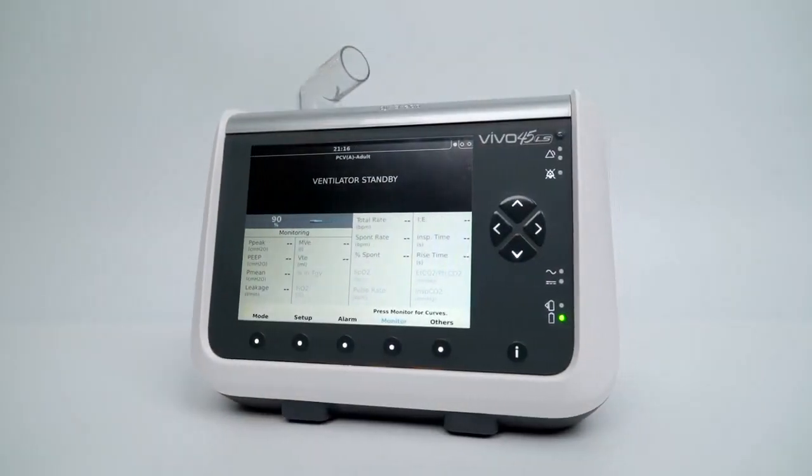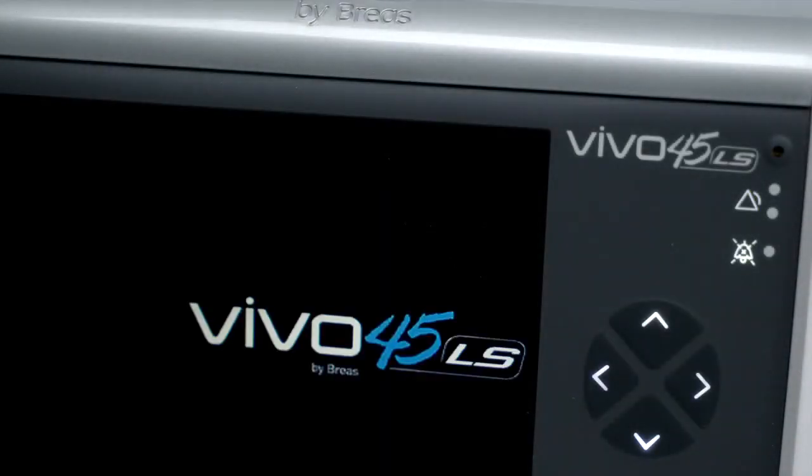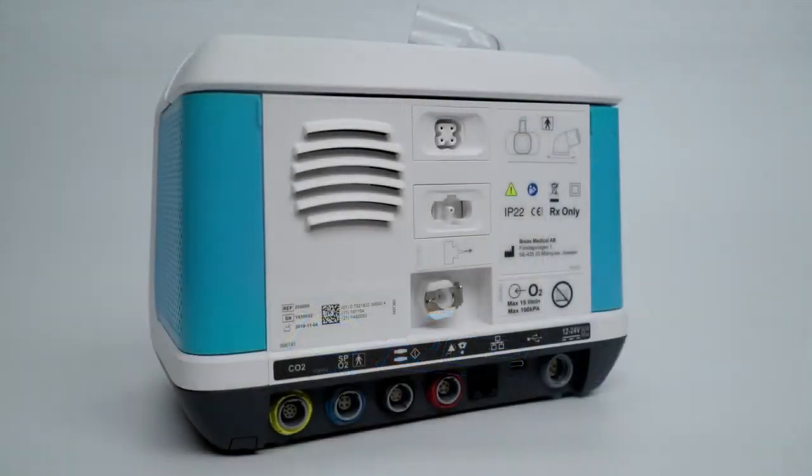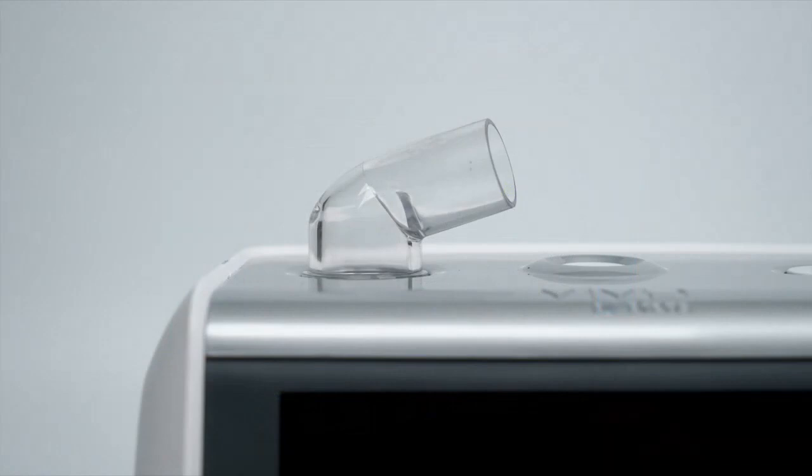Welcome to the Breas Vivo 45LS tutorial series. In this video, we will cover the functionality of the front and top panel and the procedure for performing a pre-use test. Located on the top panel of the Vivo 45LS is the patient air outlet.